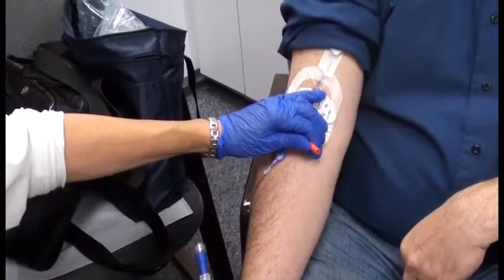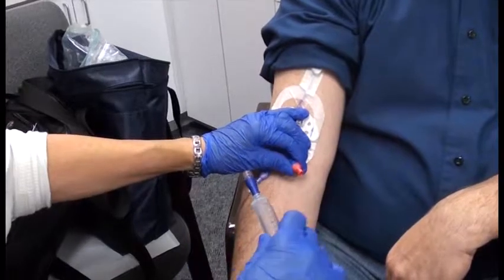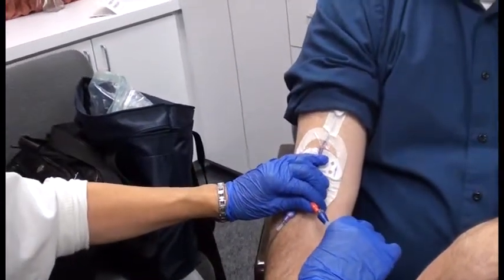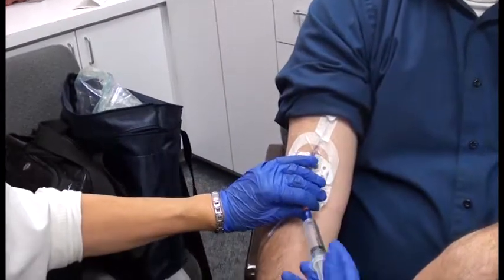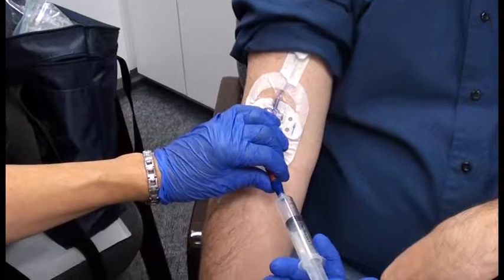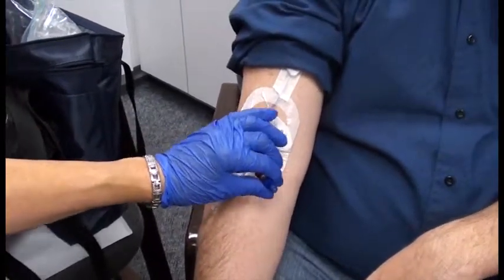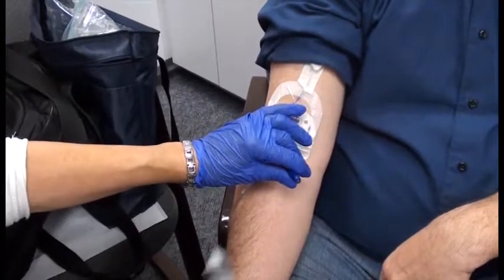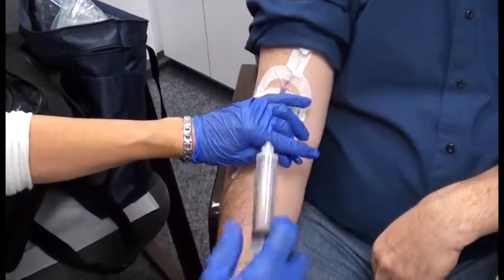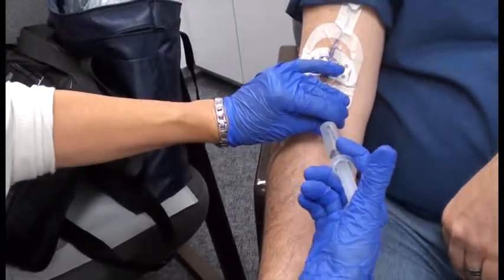We just had somebody complain that the cap didn't come off, and they were wondering why, and we decided that when it's wet and you attach it, it seals it in and locks it like glue, so the next nurse can't get the thing off. Wow, that wouldn't be good. No. Okay, and then I'm going to flush it with one more saline. It's a lot of flushing. It is a lot of saline, huh?